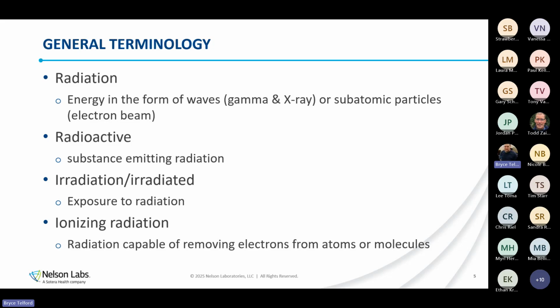So unless I have the electron beam turned up really, really high, I'm not going to have any induced radioactivity. And that's something to be very mindful of: make sure that their systems, their processes are such that they are not causing induced radioactivity to your product. Generally speaking, the beam is nowhere near powerful enough to actually cause that induced radioactivity. So irradiated just means exposed to radiation.